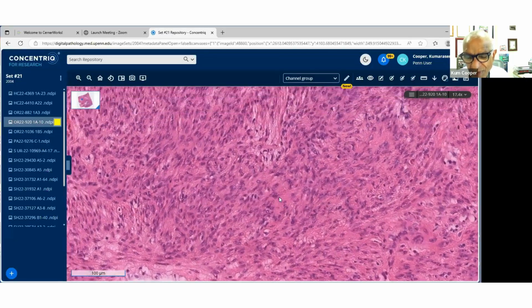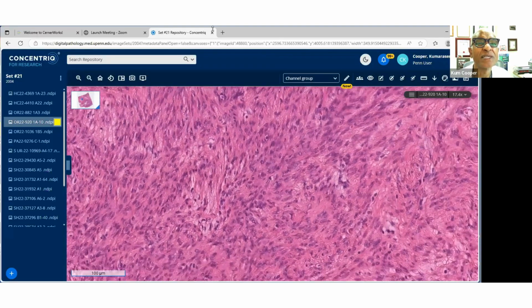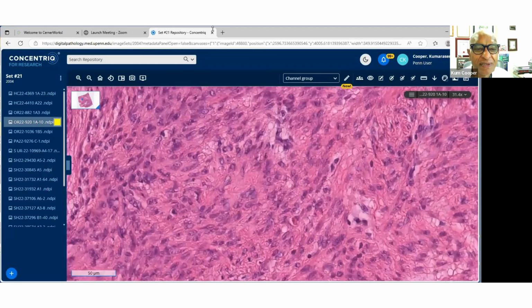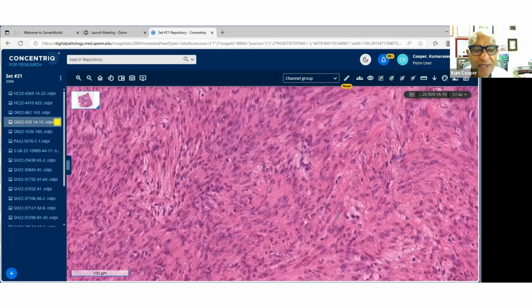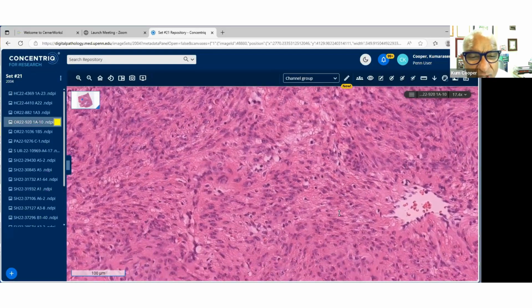Again, feel free to give us your comments. I'm going to just open the chat so I can see that live. There is a question from the previous one. Do you always do IHC for differential diagnosis on EMC and myepithelioma? I'm just going to address that question because that's a very pertinent question. Thank you for bringing that up. Just referring to the previous soft tissue myepithelioma.